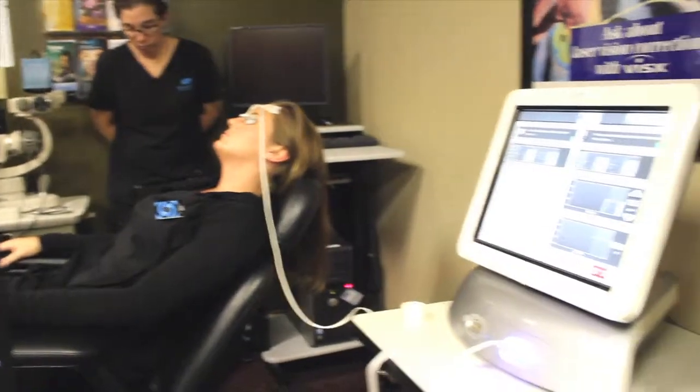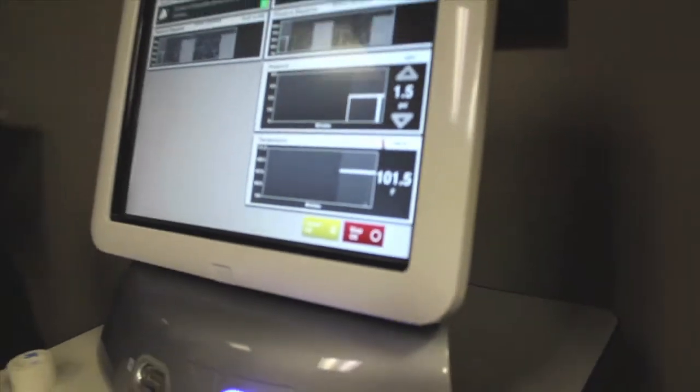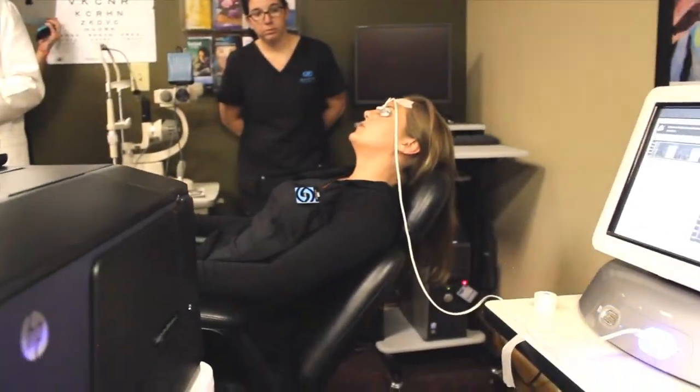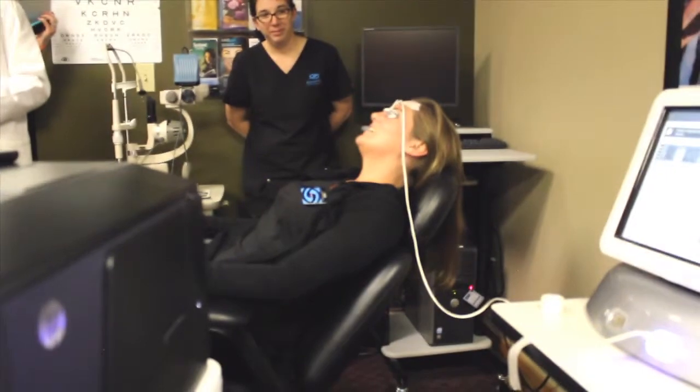So you can see it's at 98, 99. Look at the bottom right. It's telling you how hot it's getting. Can you feel it? It's getting warm? What are you feeling now? I just feel it warming up. I know you got to sit back and enjoy the last one. You're going to have to talk during this one. They want to know what you're feeling.